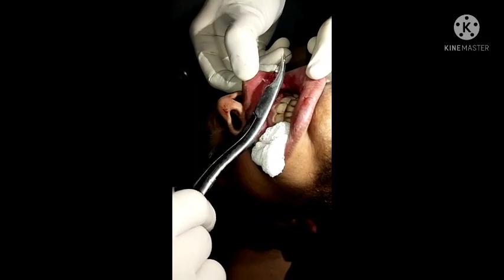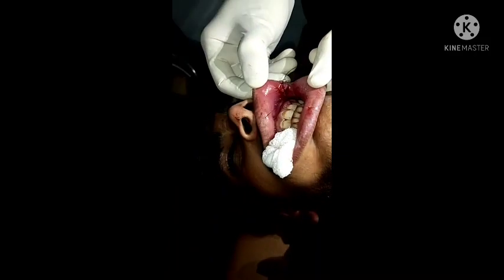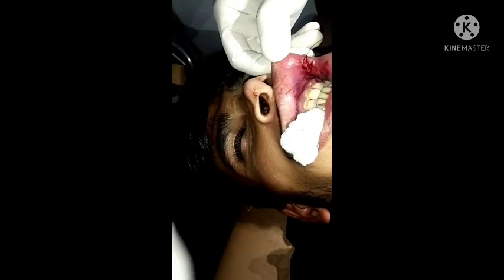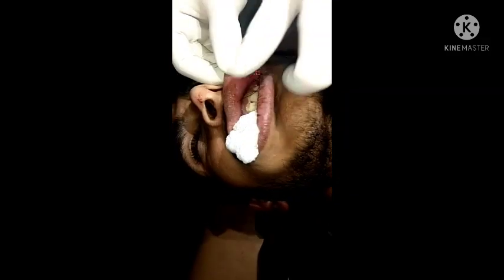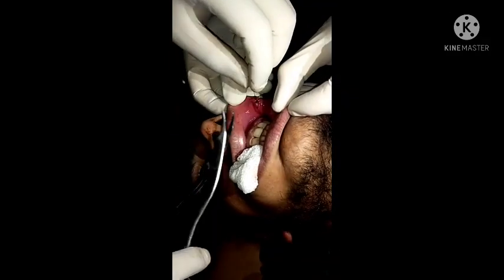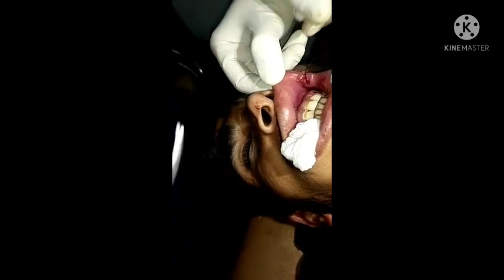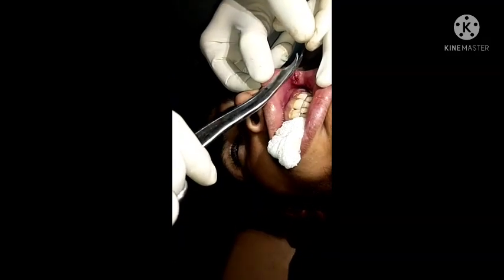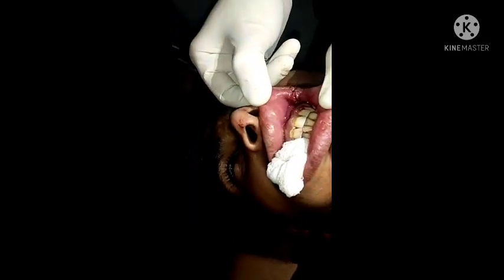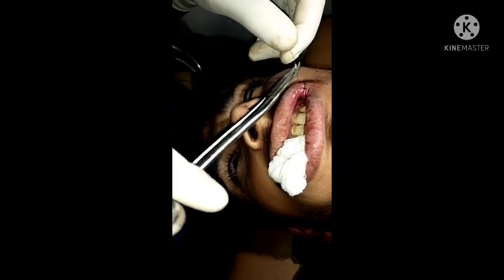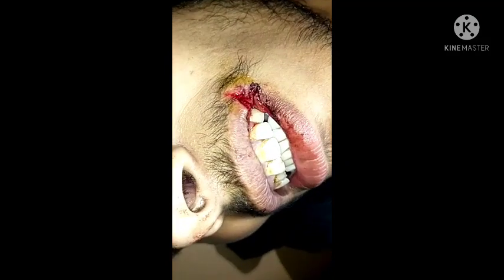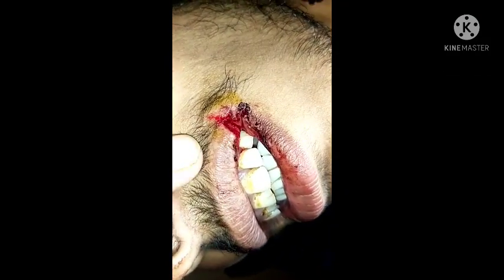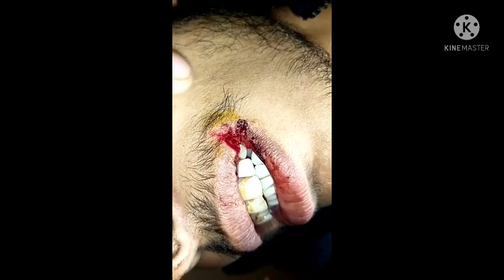Here is the final suture. After this, we have to mop it, clean it, and remove the extra suture thread. Here you can see the difference before and after the procedure.